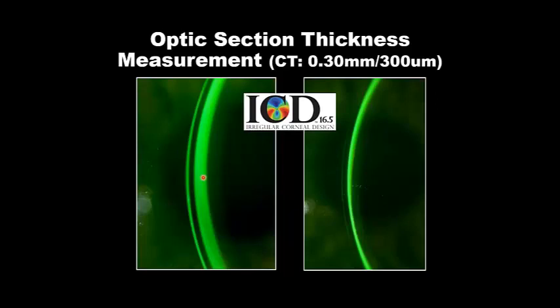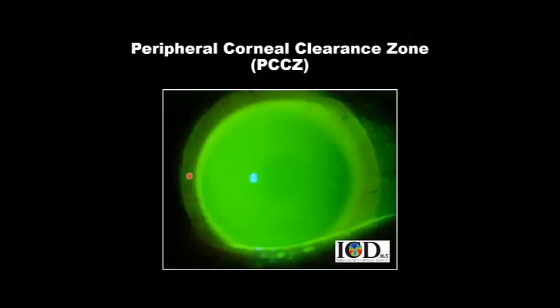Do you need to put on another trial lens? No. You can use this known clearance and modify from here. However, as I mentioned earlier, if you have touch, you have to put on another lens. You need to know what depth will clear corneal tissue.